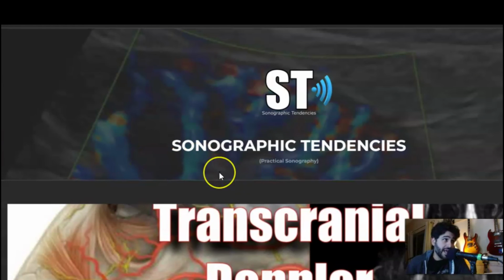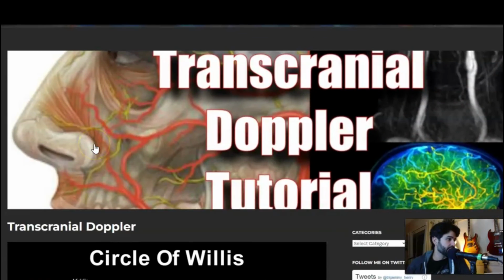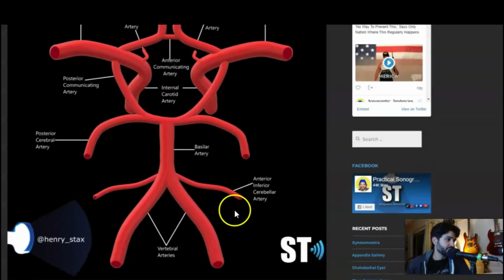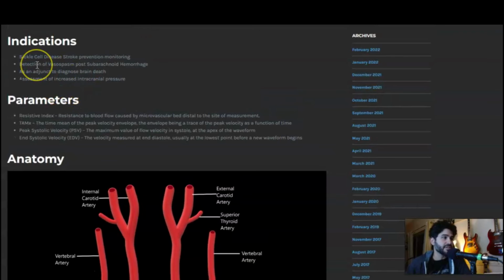On my website, I have an article on transcranial Dopplers, and I have several videos on YouTube as well. The article is a good primer if you're starting to learn TCDs. I go over the anatomy: the circle of Willis, middle cerebrals, anterior communicating, posterior cerebrals, the vertebrals, the basilar. All right, indications. In most cases, it's going to be for sickle cell disease or for people that have subarachnoid hemorrhages or any type of hemorrhagic stroke, to rule out vasospasm.